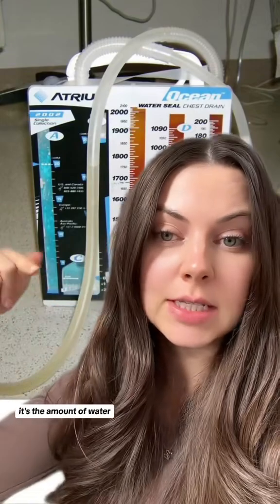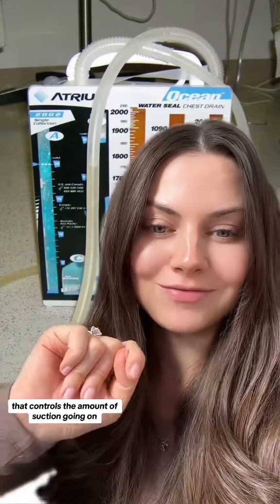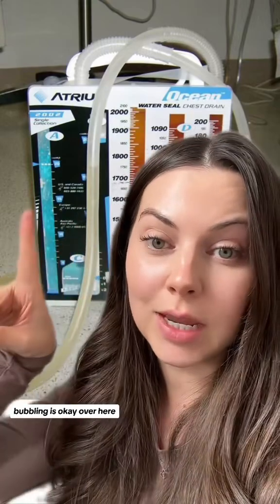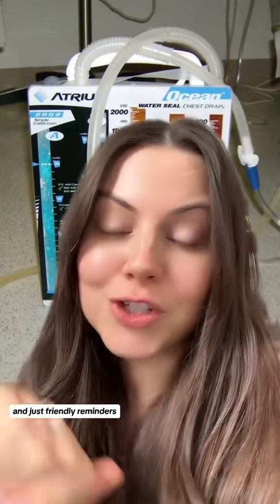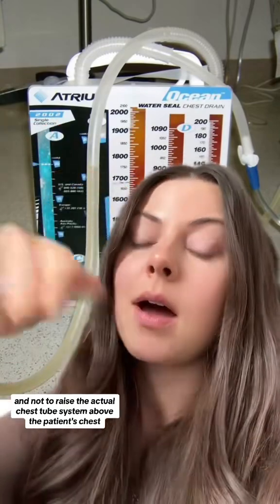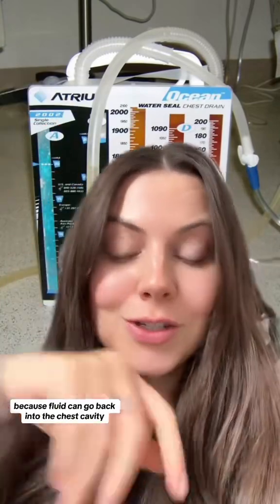With wet suction, it's the amount of water in this area, the suction chamber, that controls the amount of suction going on. When we have wet suction, so water is controlling the amount of suction, bubbling is okay over here. Bubbling indicates that the suction is working. And just friendly reminders not to kink your tubing and not to raise the actual chest tube system above the patient's chest because fluid can go back into the chest cavity.